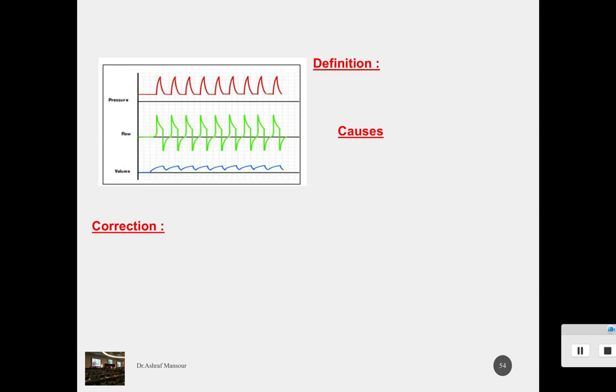Baby on SIMV, and this very high rate, and the baby starts to wash out. Although you can find that the X-ray is still bad, or the condition of the baby, you believe, is bad, but the baby is washing out CO2, maybe there is also a metabolic element.